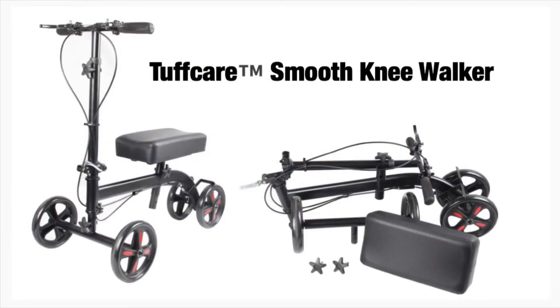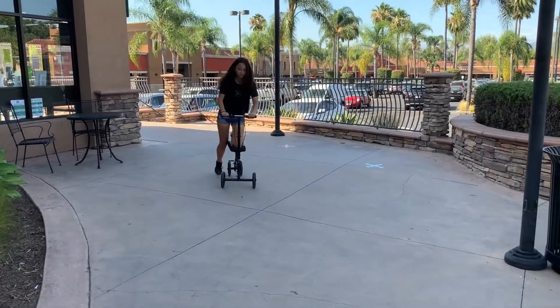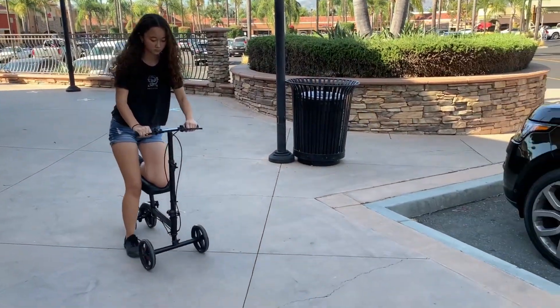This is the Tuffcare Smooth Knee Walker. This knee walker is ideal for indoors and flat pavements. This product is designed for individuals recovering from foot surgery, sprains, amputation, and ulcers on the foot.